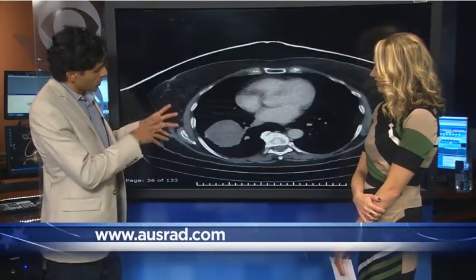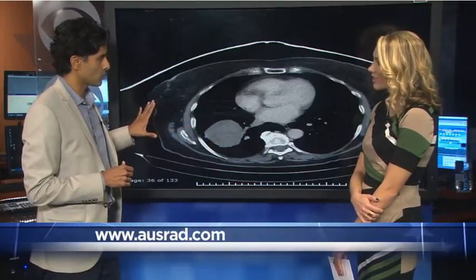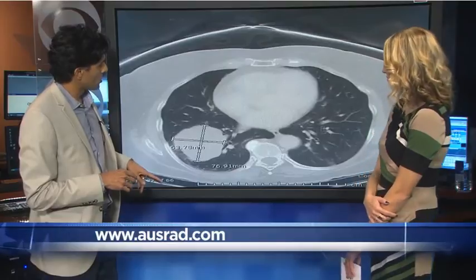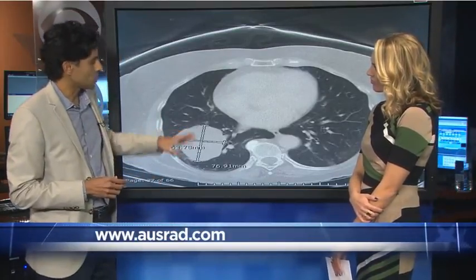This is a very large cancer in the right lung, this big mass right here. That looks scary. What you may notice is that this image is less bright than the other ones I've shown so far. That's because we utilize different ways of looking at images, called windows, to assess all parts of the patient's anatomy. This is what's called a soft tissue window. And on our last slide, this is what's called a lung window. This is the same mass, same patient, but seen in a different way.